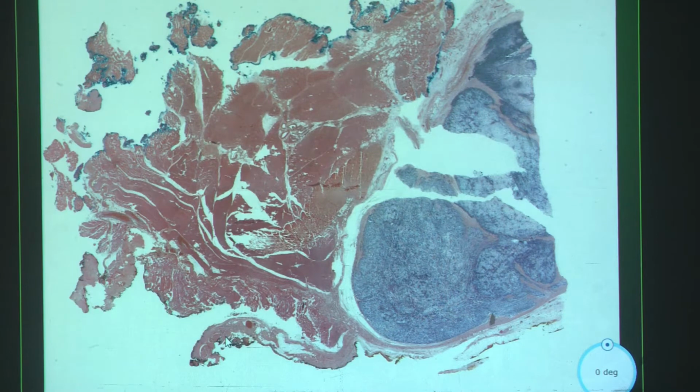This is case 6. So again, here we have our nondescript soft tissue. Here is obviously our lesion, so I'm just going to zoom in on that. And what we notice is that we have a very biphasic appearance right away, where we have areas that are really pink and areas that are kind of blue, and there's kind of almost an edematous look maybe in between.